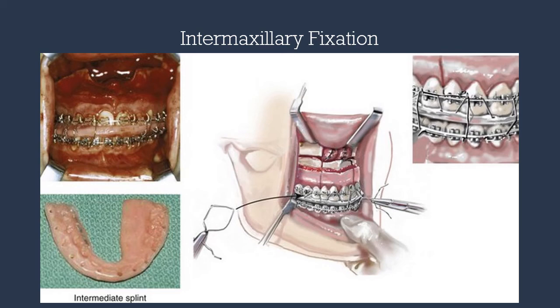Once the surgical guide is secured, we move the maxilla into the new position and ligate the upper and lower jaws into fixation using 26-gauge wires with wire drivers, ligating posteriorly as well as anteriorly. On top of the wires, elastics are used in case any wires lose tension.